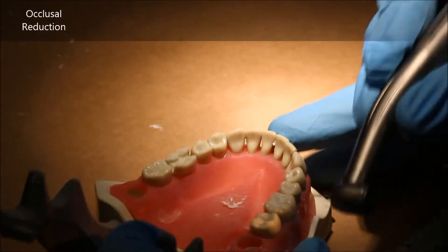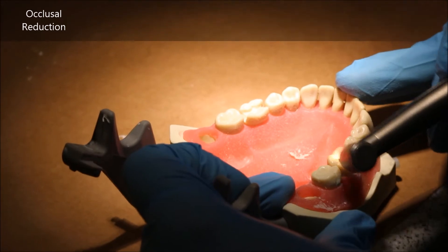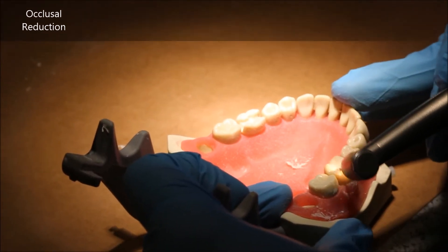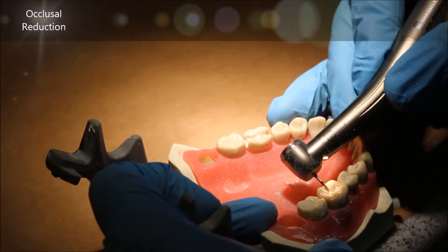You start occlusal reduction by making depth cuts. Depth cuts are one millimeter cuts that you make in the occlusal table's grooves and/or on the triangular ridges.